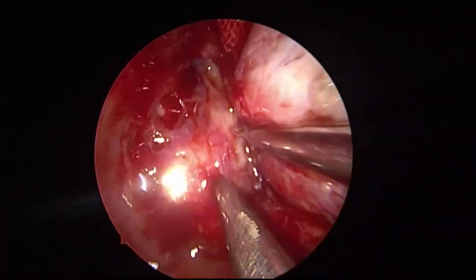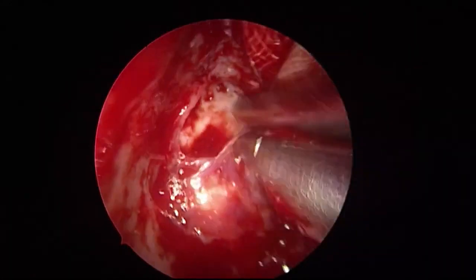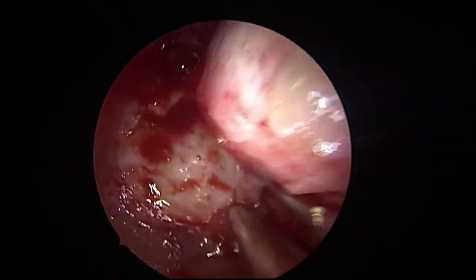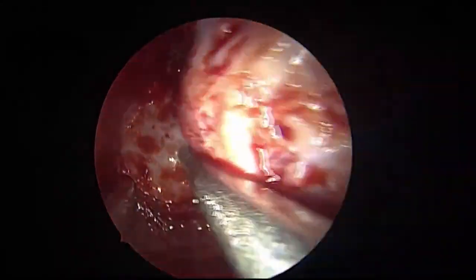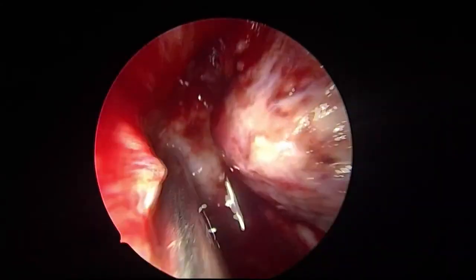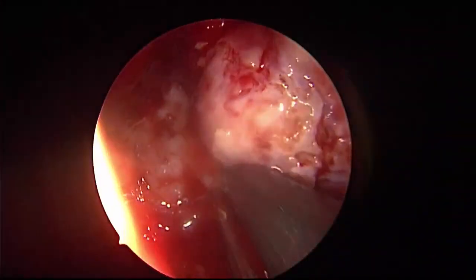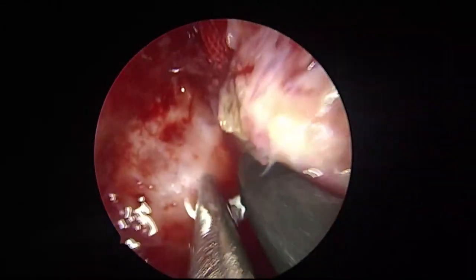See now the entire maxilla is exposed. See the mucosa of the posterior wall I can remove. See the belt of the tumor from behind? Clearly seen. Now I'll do something more to this tumor to shrink it. As more and more tumor surface is exposed, more and more coagulation to shrink this.